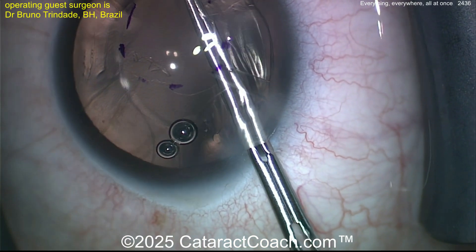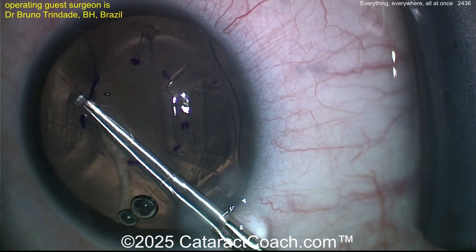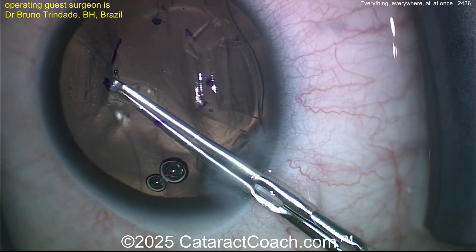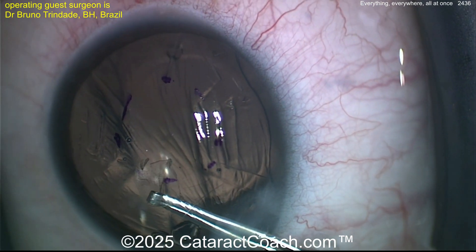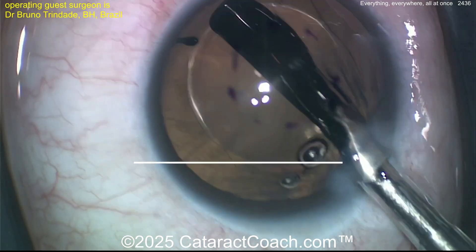Now here's the DSO — a central 4 millimeter Descemet stripping only — being careful not to touch the rest of the corneal endothelium. Nicely done: DSO, Descemet stripping only, four millimeters or so.